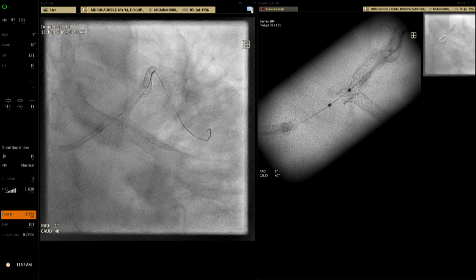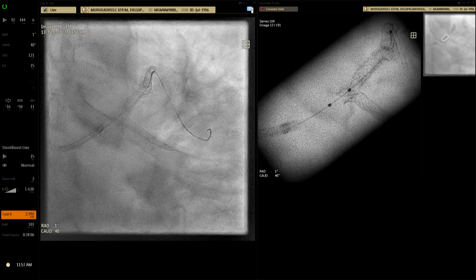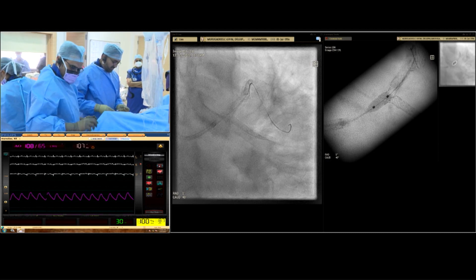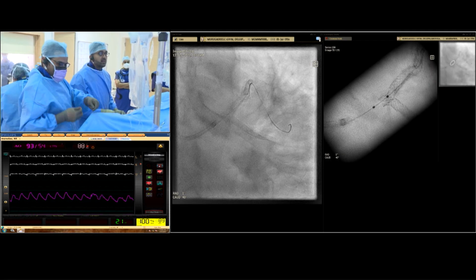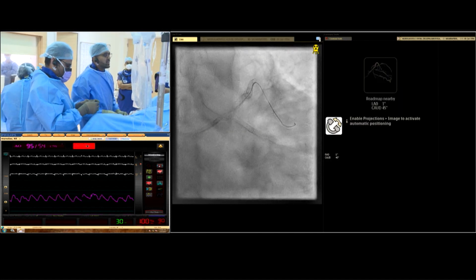I need a wire and a new 3 balloon. So we're going to rewire, recross, and then take a 3 balloon. Very little stent in the left main for a POT, actually. But yes. You could always put one short stent if needed in the left main. We will do an OCT because the left main was short anatomically, which was largely disease free.